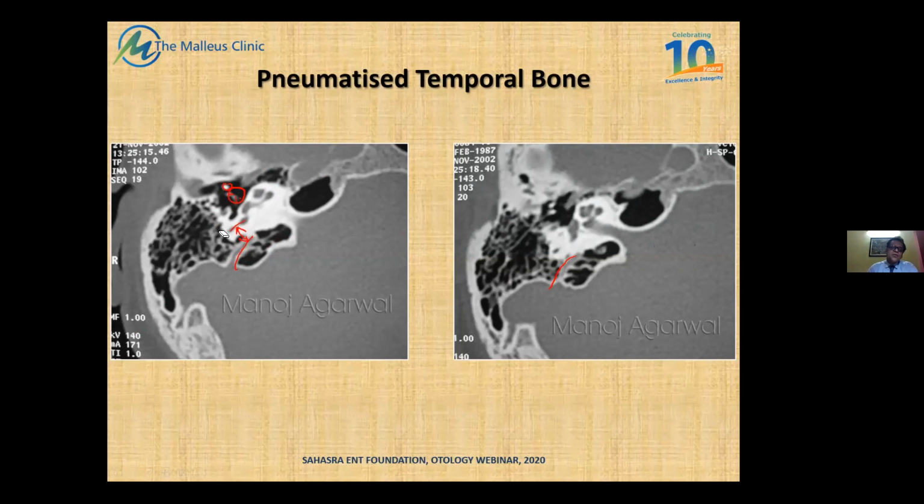Okay, now, quick question, where is the facial nerve here? This is not the facial nerve here.